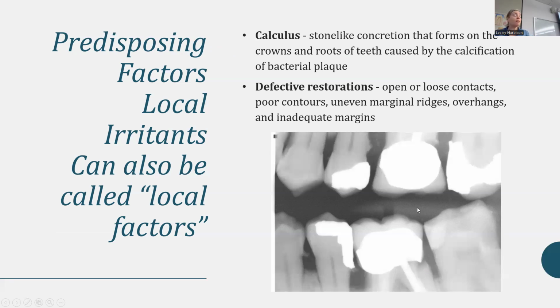And then on top of that, it could be bad dentistry, but their oral hygiene is probably going to be harder to keep good, and then they might be just neglectful in general. So then it compounds it. But I don't see how anybody could take really good care of overhangs like that in general.